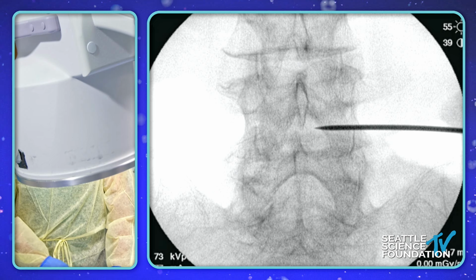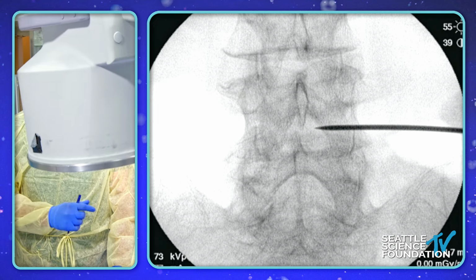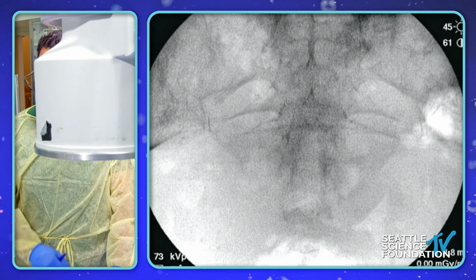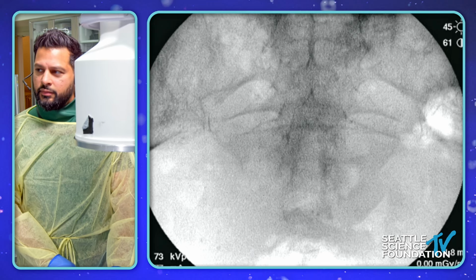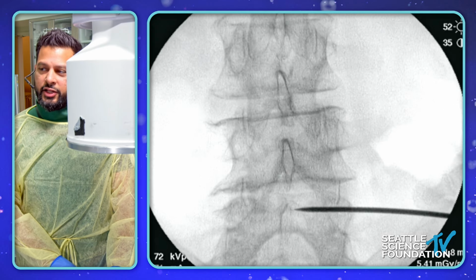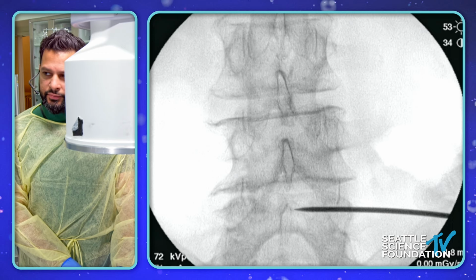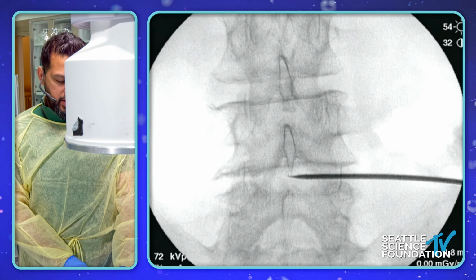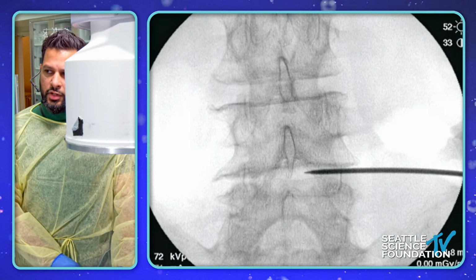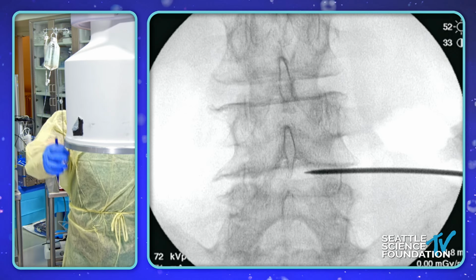Now, just for the sake of showing the opposite angle, I'll go back to neutral, and as you come back to neutral and take a shot again, you'll see the window's changed again. Shot. Come back up north. Meet in the middle, right there, south. You see now the window is a lot smaller, and my starting point is lower now. So shot there again. Okay, up there, shot there, and shot there. So you can start anywhere along the interlaminar edge, but can you guys show the angle right now? Now it's neutral.